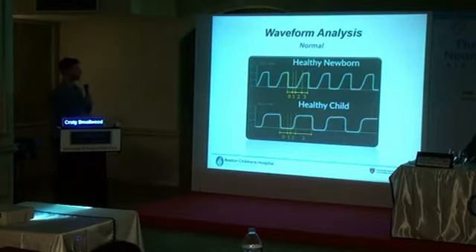Unlike probably a term baby or a healthy child, where everything takes a little bit more time and we have time to get a good, nice plateau. But we have the same thing: inhale, begin to exhale, conducting airways, mixing phase, alveolar phase. Nice end-tidal CO2 right here. And the measurement, there's a couple of differences in how the technology is applied, but in its purest sense, the end-tidal CO2 value, the number that you see, would be ascertained right here, at peak exhalation, right before the next breath begins.